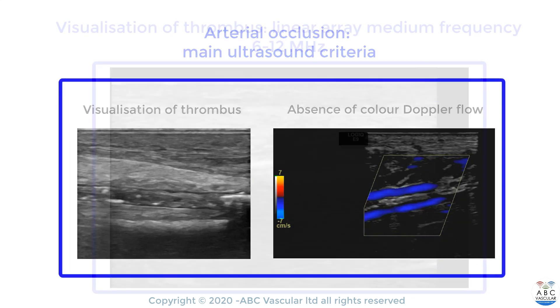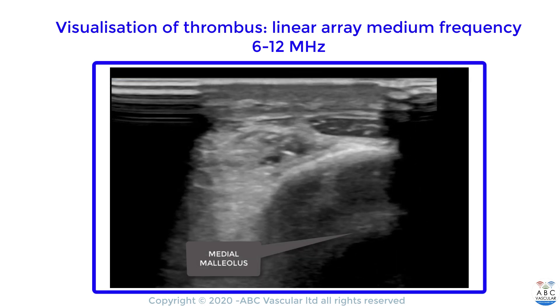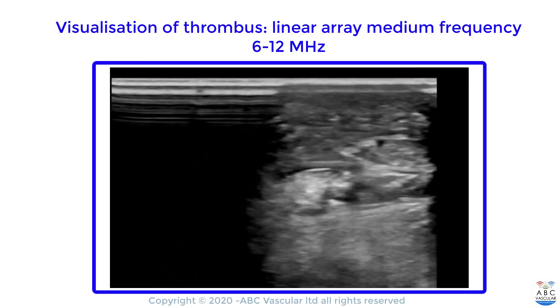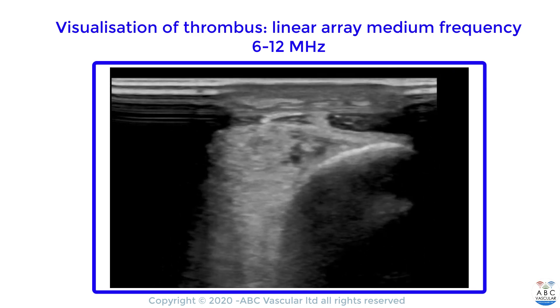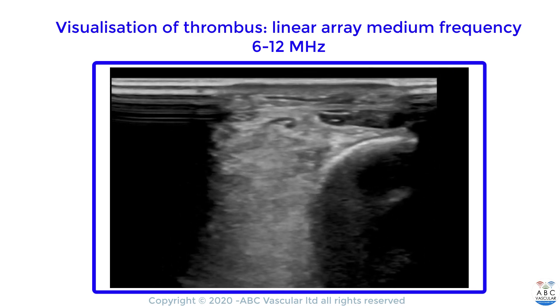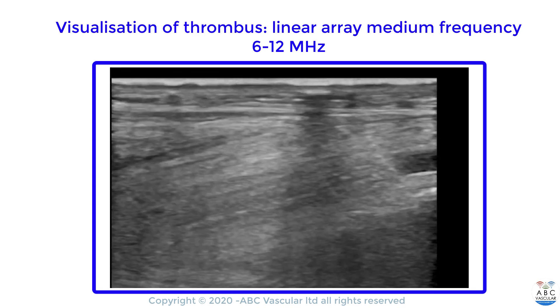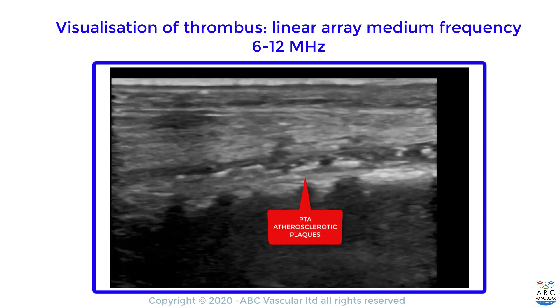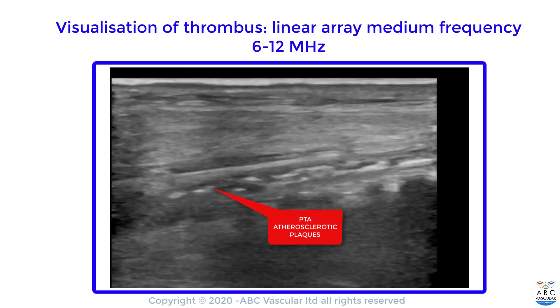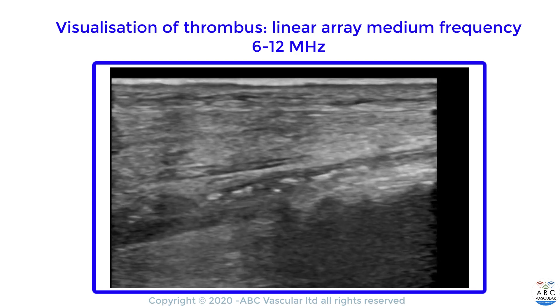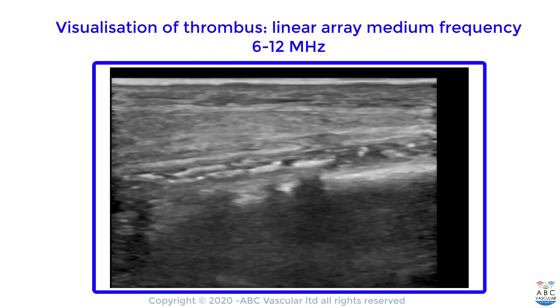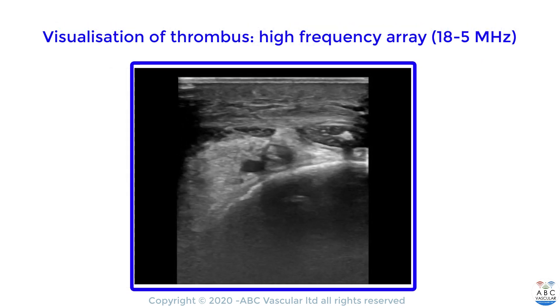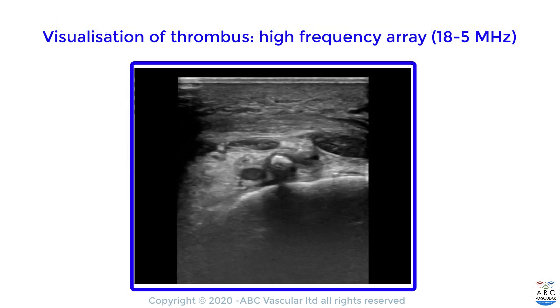The posterior tibial artery is a superficial structure at the level of the medial malleolus, therefore we can use a linear array to identify such artery and to visualize the presence of atherosclerotic disease throughout the posterior tibial artery. In order to improve the visualization of such atherosclerotic disease, we can use at the level of the distal posterior tibial artery a linear array with higher frequency.